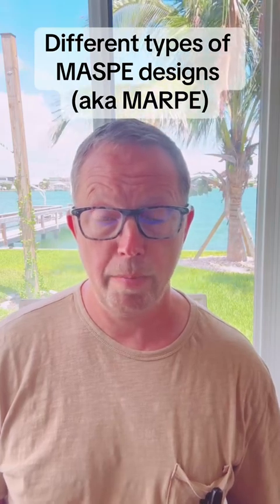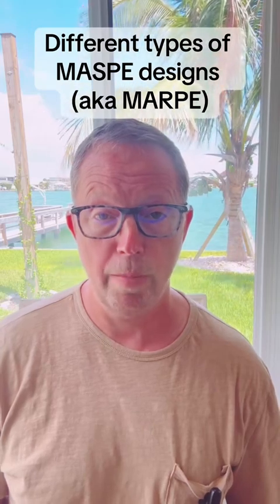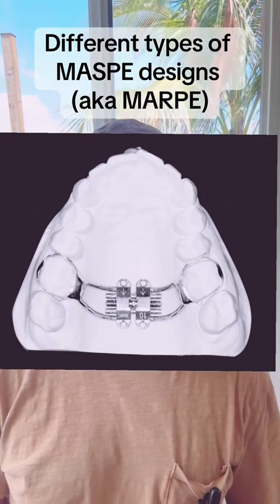If we are expecting a palate to be more difficult to open up, we will also be more likely to have the MARPE connect to both the palate and the teeth. When a MARPE appliance connects to the palate and the teeth, we call that a banded MARPE. Sometimes we not only need to expand the palate, but if we have teeth that are leaning in, we might want to lean them back out. In that case, we can use the bands on the teeth to upright the teeth — that would be a reason to use a banded MARPE.